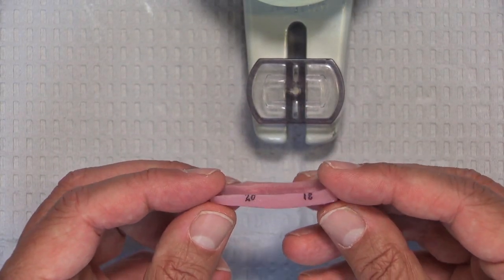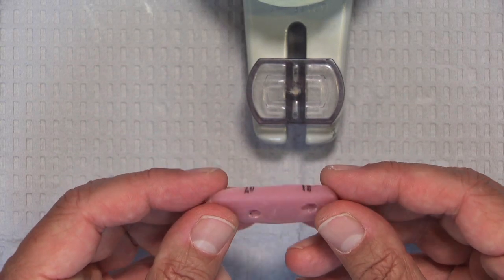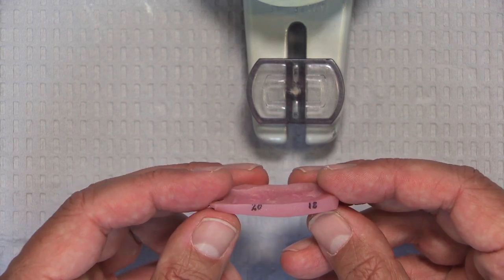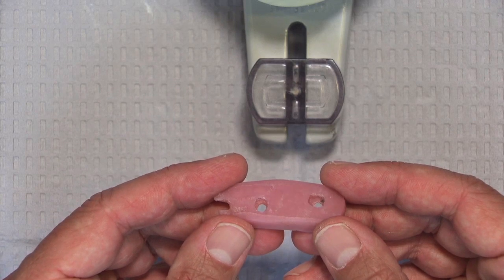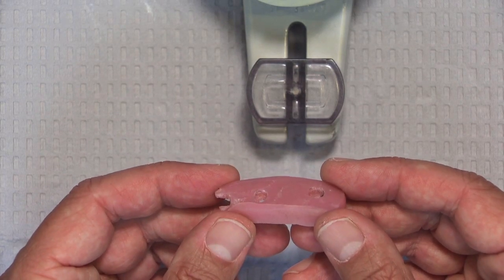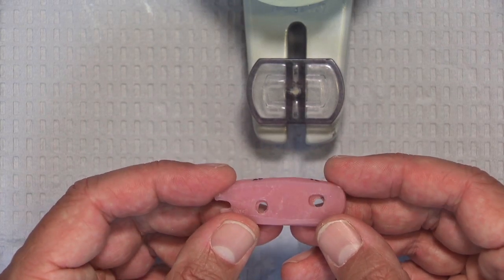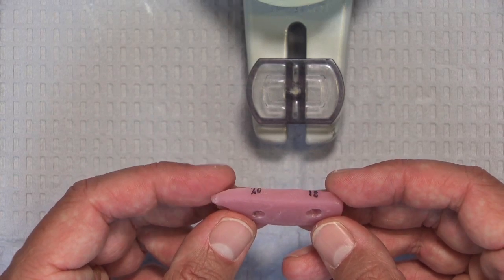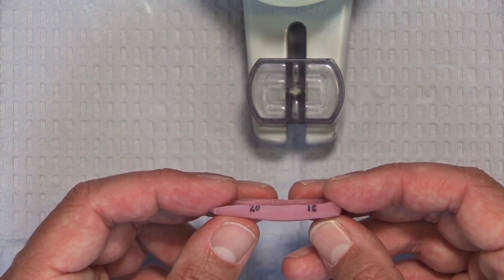This is the positioning and bite index as it comes back from the laboratory. It's easily marked so you can see where number 18 and number 20 are. We're going to use this to do two things. We're going to use this to position the custom abutments in the mouth and to verify and/or take a new bite registration in a really sturdy manner that's going to give a very accurate bite relationship to the laboratory, so that we minimize our chances of having to make a lot of adjustments at the seat appointment.